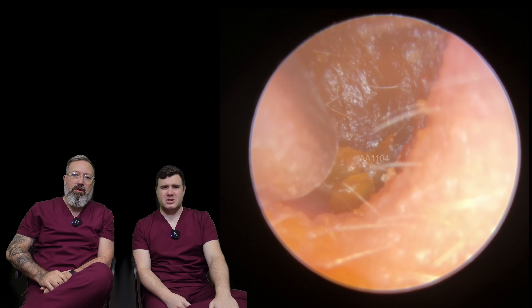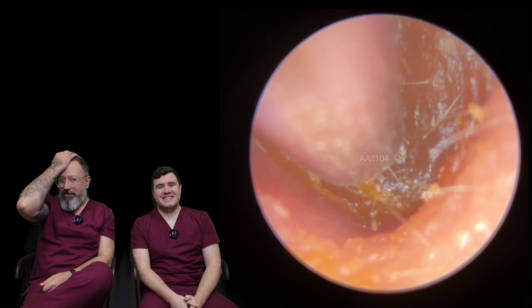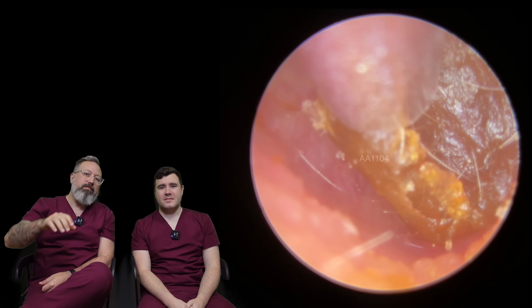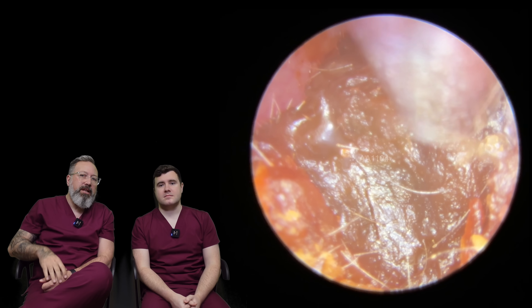It was solid. I shouldn't have touched it — I thought it's not too bad. Because you never tell with that surface whether it's going to be soft or rock solid. But this was rock solid. And what made it worse — you'll see in a couple of seconds — there is some dry skin in here which is holding it in.